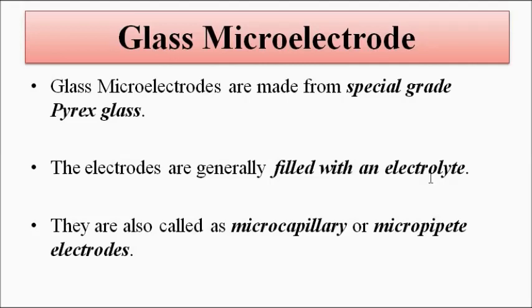Basically the characteristic of the electrolyte is that it should contain specific ions, basically chloride ions, because the human body is also composed of various types of electrolytes: sodium, potassium, chloride. So the electrolyte should also be composed of the same ions that are generally found in the human body in the same concentration.